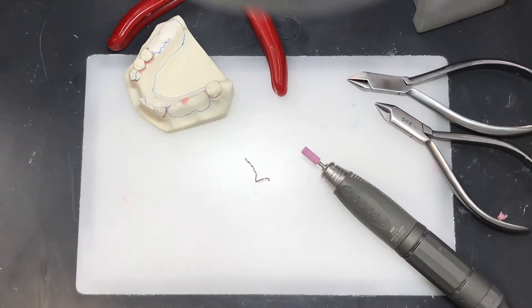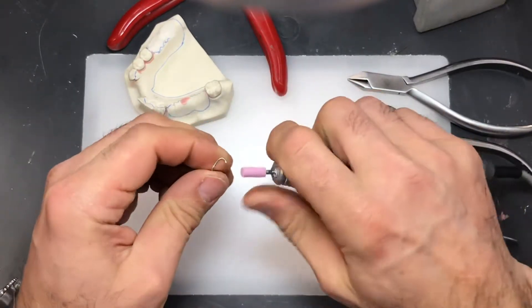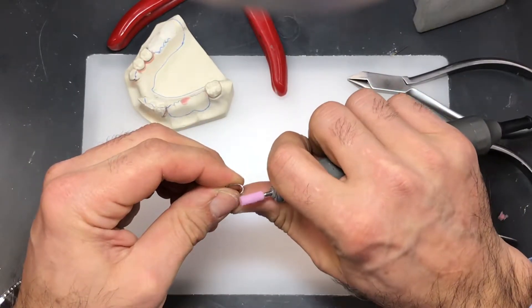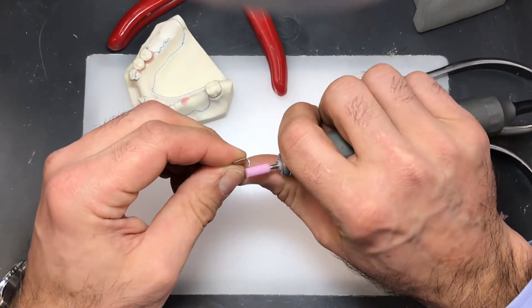You can taper it somewhat with a grinding stone as well if you want to get in a little bit finer. I'll show you on the last wire that I'm going to bend how to do that.